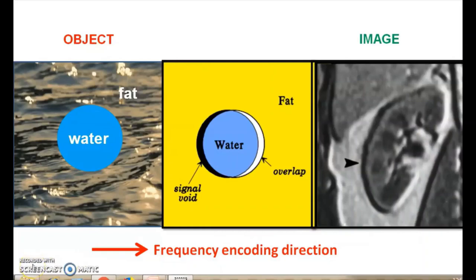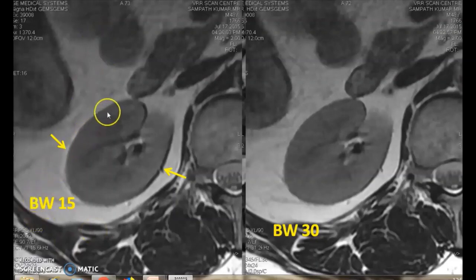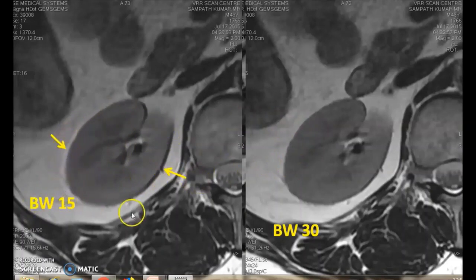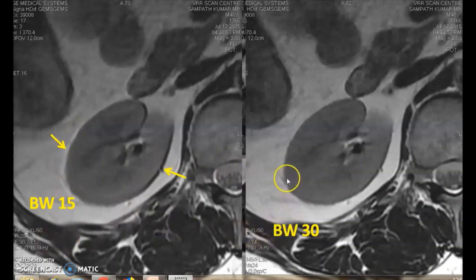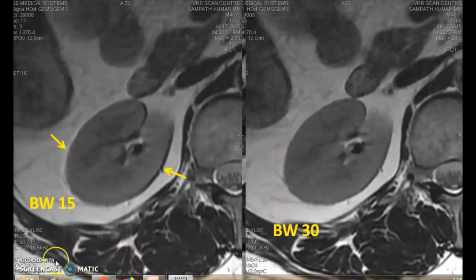This chemical shift artifact depends on the bandwidth. By increasing the bandwidth, you can eliminate the chemical shift. Here is the same sequence repeated with two different bandwidths — at bandwidth of 15 you can see white lines and black lines. By doubling the bandwidth, there is no chemical shift artifact and both lines are eliminated. So when you don't want chemical shift artifact, increase the bandwidth and it will disappear.